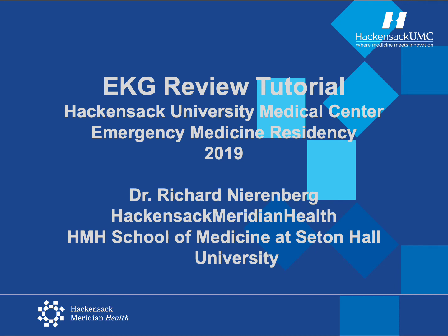Hi. The purpose of this tutorial is for the learner to review all aspects of reading electrocardiograms, from the very basics up to the point of being able to be certified to read triage EKGs in the emergency department. The review will start with the really very basics, things you learned your first rotation in medical school, but then we'll proceed through core concepts to the ability to trace and identify tracings which need immediate action, and also those in which the tracing gives you important information short of activating the cath lab.